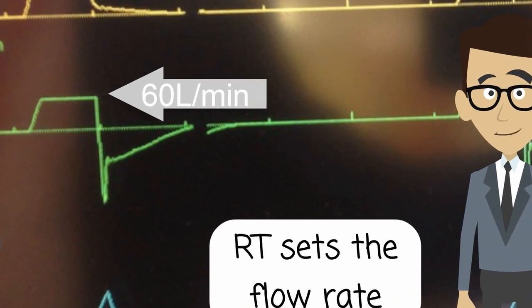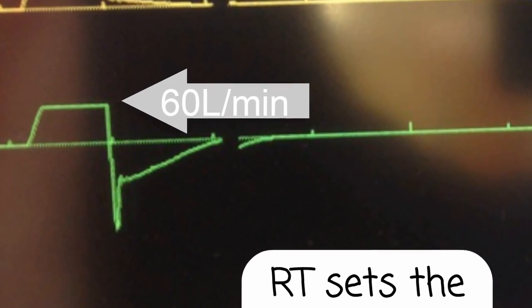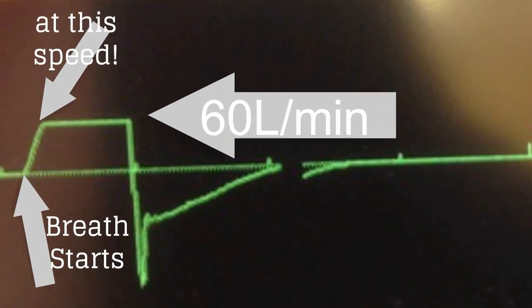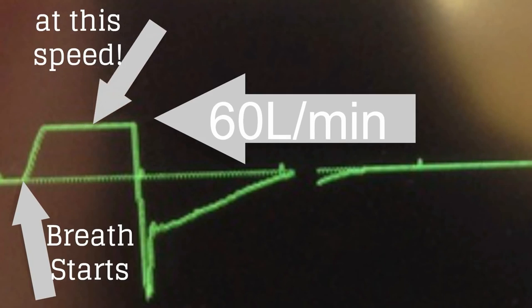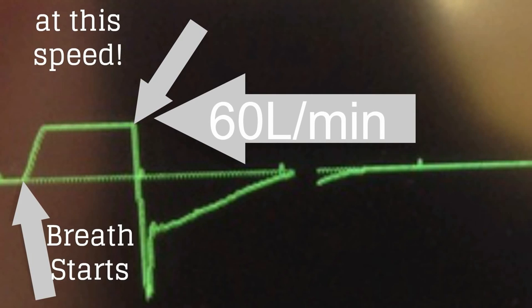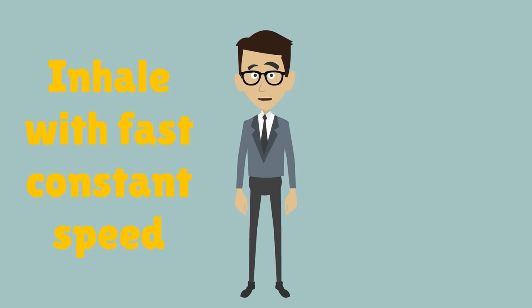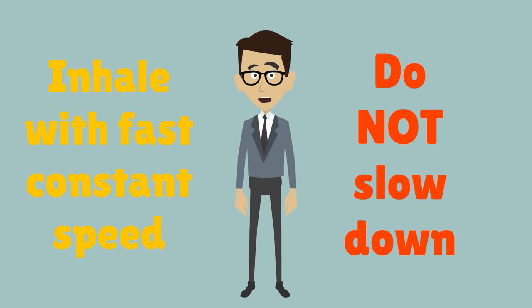With a traditional square waveform, this means that when a patient starts their inhalation here, the breath will start at a high speed here. Then, as the patient continues to inhale, they do not slow down their speed. They will maintain the fast, constant speed for the entire inhalation. You can try that now. As soon as you're ready to inhale, begin with a fast speed and keep it constant. Do not slow down or speed up as you inhale.